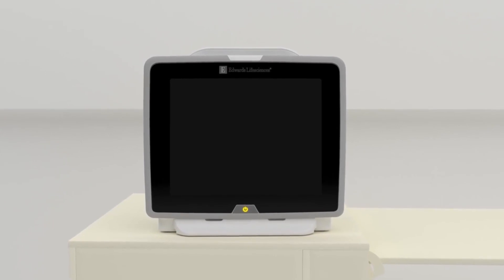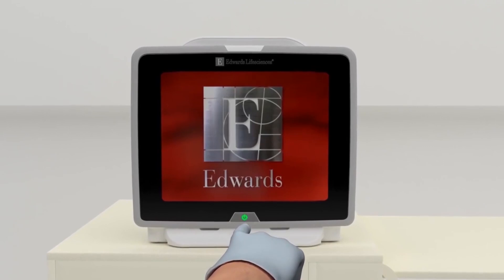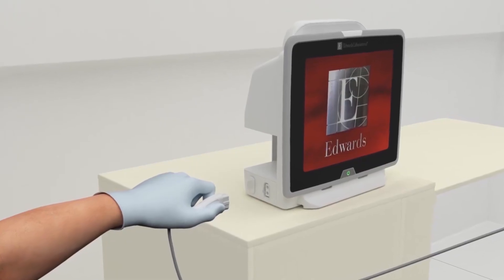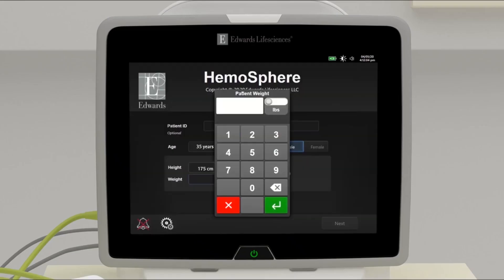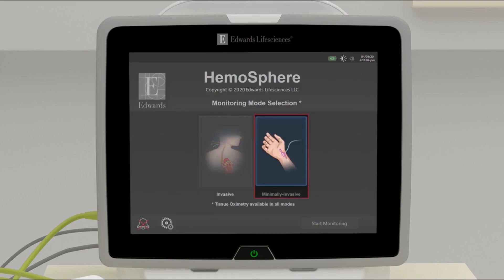Press the power button on the front of the monitor. Note: upon initial startup, the display language can be selected, which affects the time-date format and units of measurement. Insert the desired hemodynamic technology module and/or insert pressure cable. Enter and confirm patient demographics, then select monitoring technology.